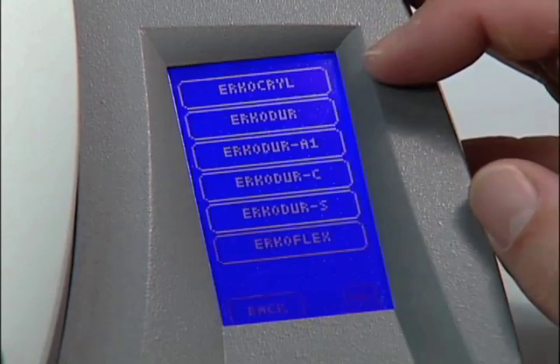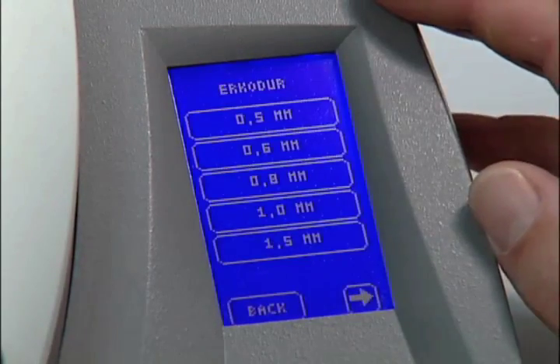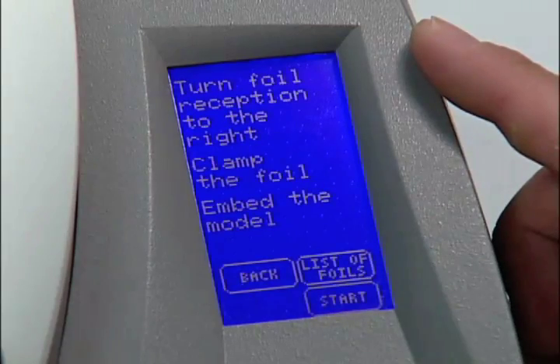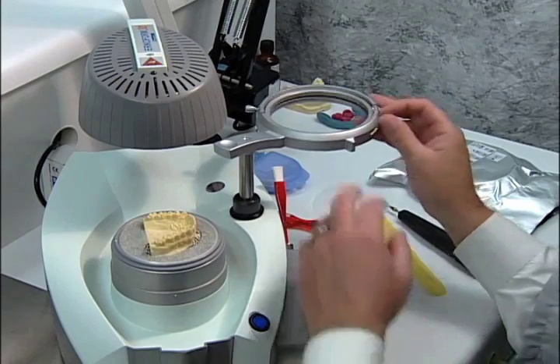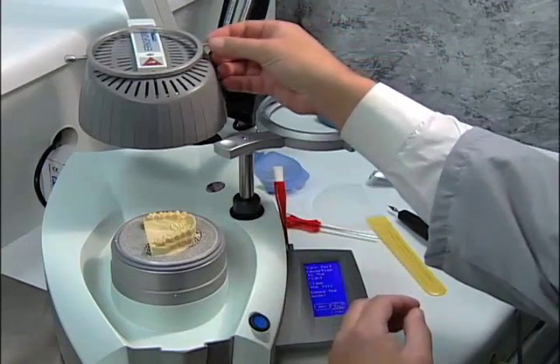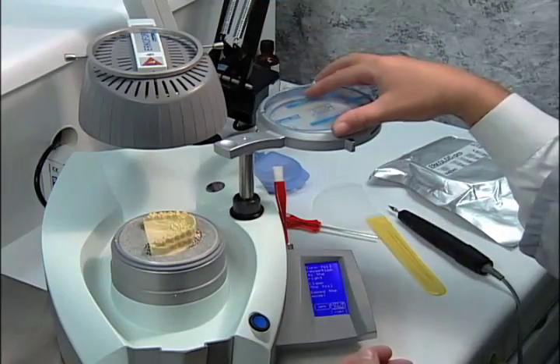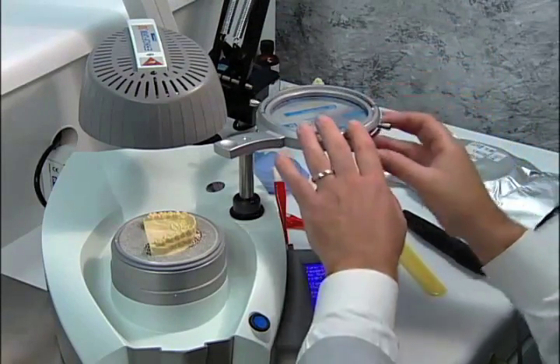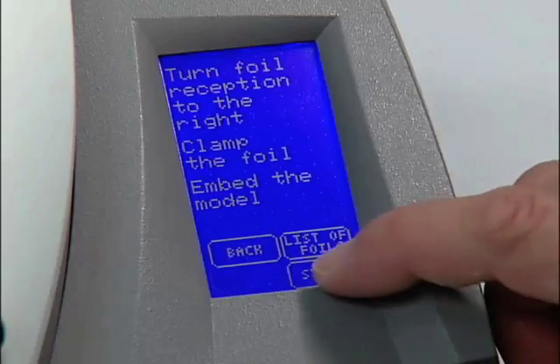Go to the touch screen and select the correct material to be formed and press Continue. Take off the foil lock ring and load the Erkodur foil spacer label down. Press Start.